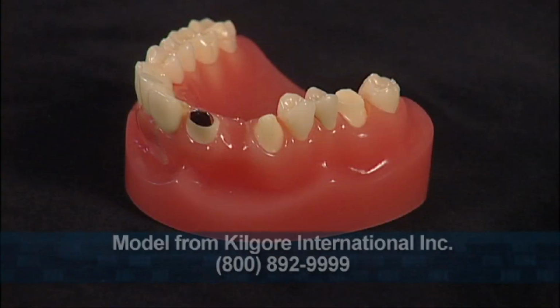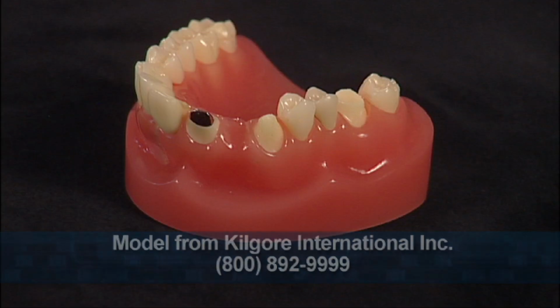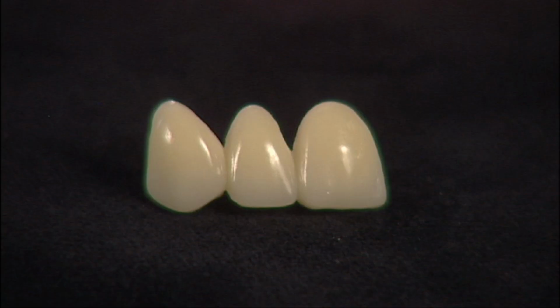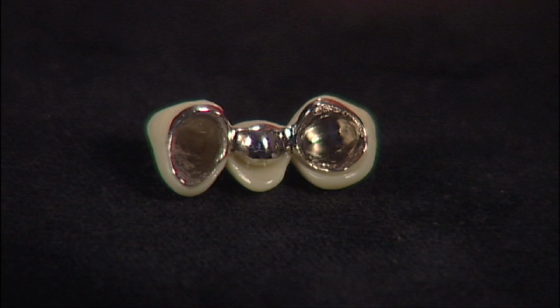The porcelain fused to metal fixed bridge is by far the most used form of fixed bridge in dentistry. The dental model you're observing has one missing tooth in the front part of the mouth. The teeth on each side have been prepared by the dentist for a fixed bridge. The piece of metal is a reinforcement of that tooth. The fixed bridge has ceramic fired onto metal on the inside of the bridge.